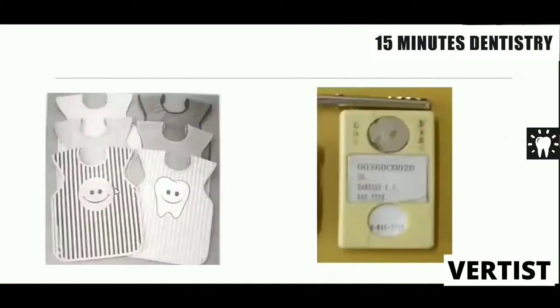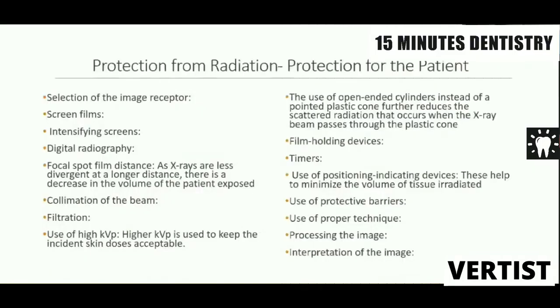These are happy little lead aprons which the operator doesn't use, but the children who are being radiographed are covered by this. This is the TLD badge with which you can monitor the amount of radiation you are exposed to. Protection for the patient.